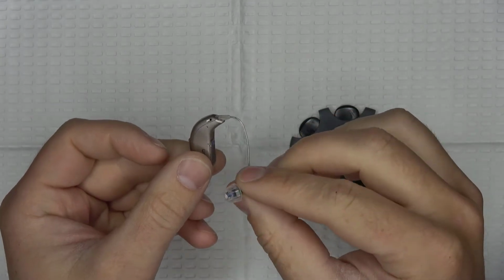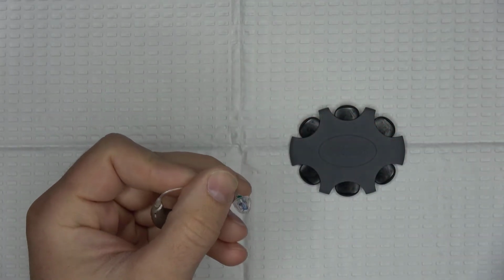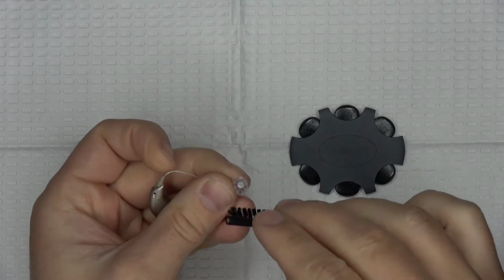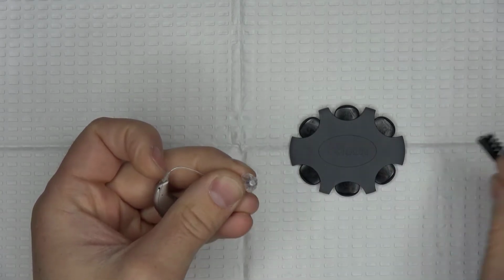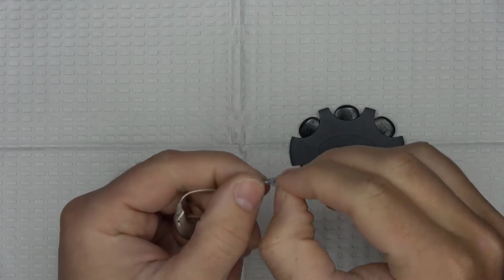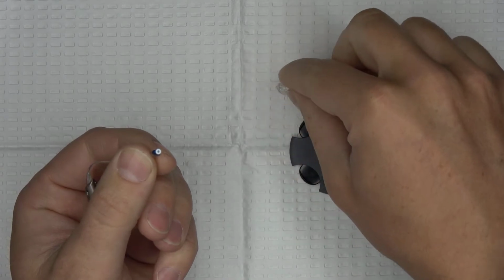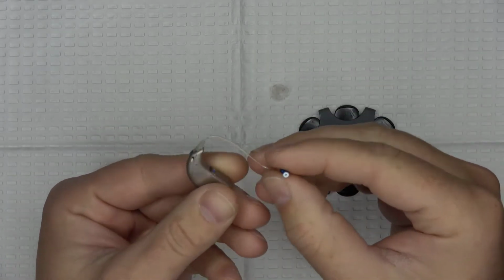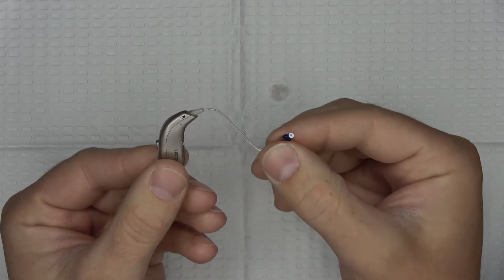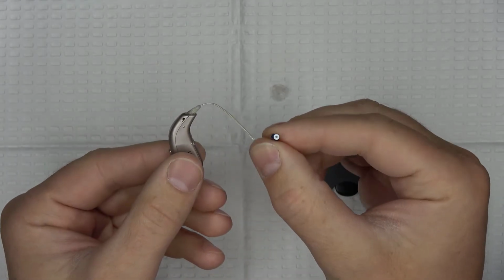If there's any buildup of wax on the dome, start by brushing this off and proceed by taking the rubber dome off of the receiver by pinching the dome and peeling it away from the receiver, similar to the way that you would peel the backing away from a sticker. Once the dome is removed from the receiver, take a look at the opening of the receiver, and you should see a small white cap at the tip of the receiver. This is the wax guard.